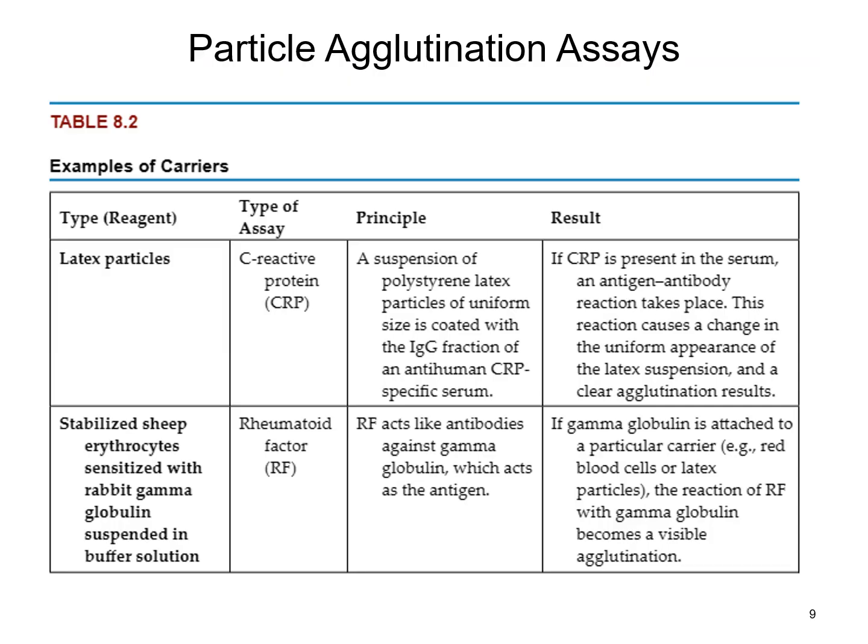Occasionally we have to introduce some sort of artificial carrier particles to our test method in order to actually be able to visually see those antigen antibody agglutination reactions. Examples of this would be latex particles or a form of charcoal, as well as erythrocytes. Your textbook has a nice chart that gives you some examples of this. If you're currently working in a lab, you may have seen these tests before, something like a slide test for C-reactive protein or rheumatoid factor.